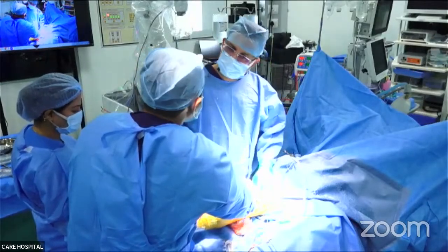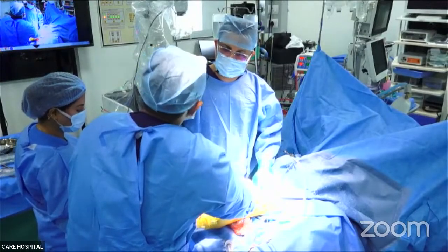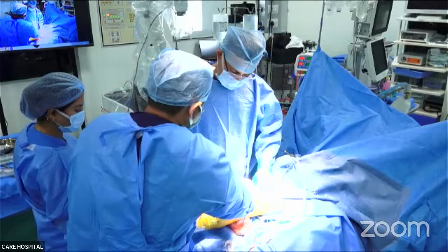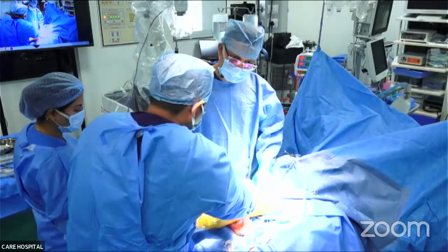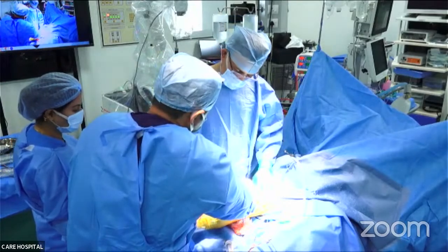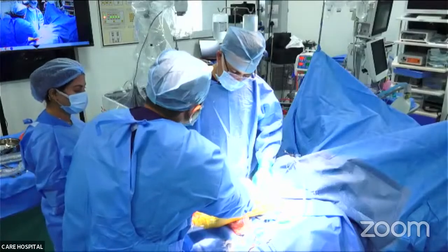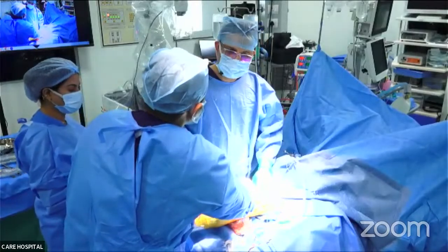The rest is the standard protocol. Tomorrow you can make him walk and everything. The effect is quite small so it won't matter. If the stem was there, then as a precaution we could have put a stem, otherwise also it's okay.